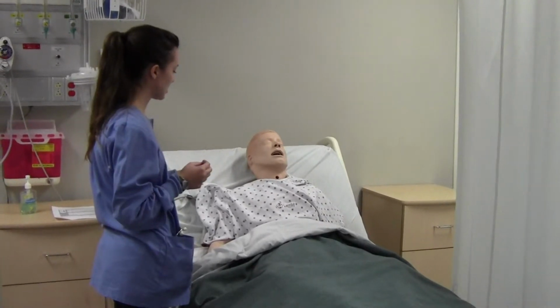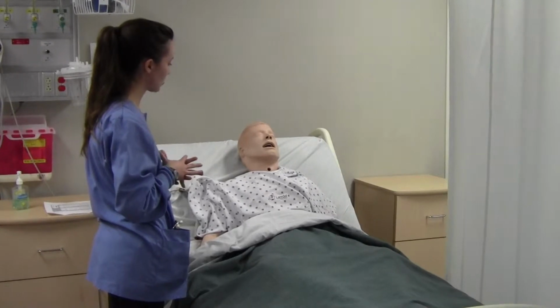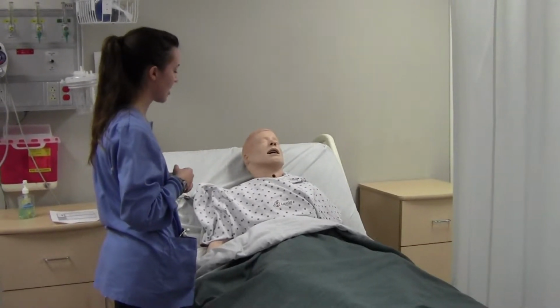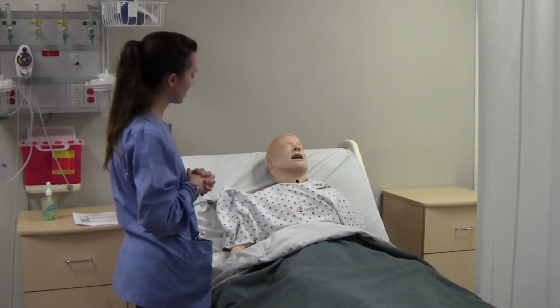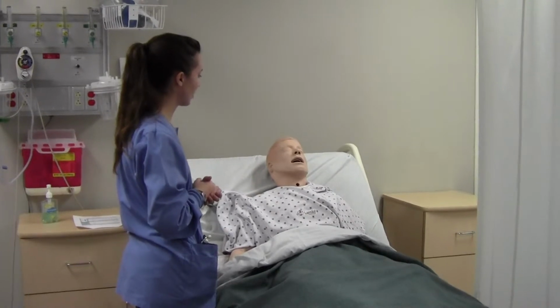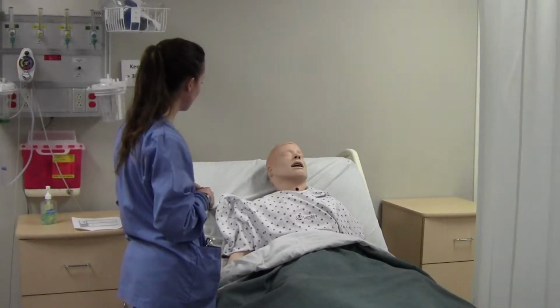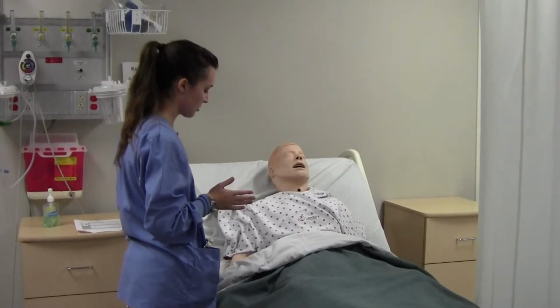When it's all the way in where we think it should be, I'm going to pull back a little bit on a syringe. We're going to make sure that we get stomach contents out. I'll check the pH on that, and once we have that all set, I'll hook you up to intermittent suction. Do you have any questions on that at all? No? Okay, alright. I see that you don't have a pillow already, so that's good. You decided not to have a pillow today. It's more comfortable? Okay. So that's good.